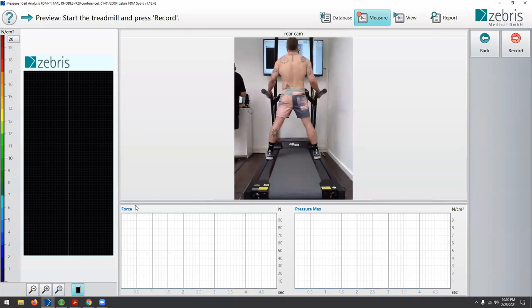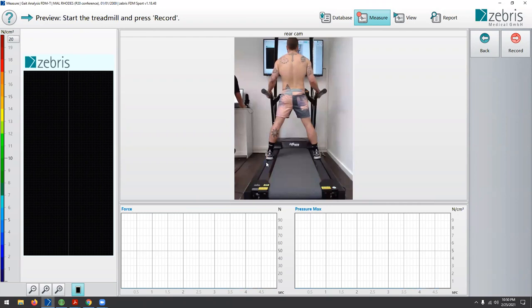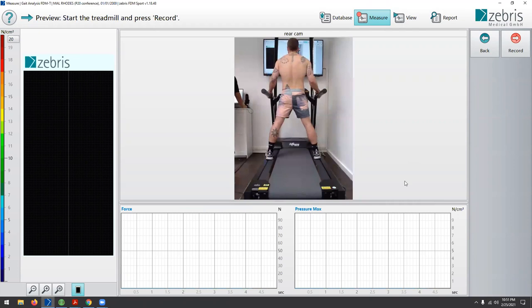We thought we would show you what we implement as the mainstay of the rain room concept — how we include an instrumented treadmill into clinical practice, as well as Simi-Aktysis, which is a high-speed motion capture system using active markers. We're lucky enough to have Malcolm join us.